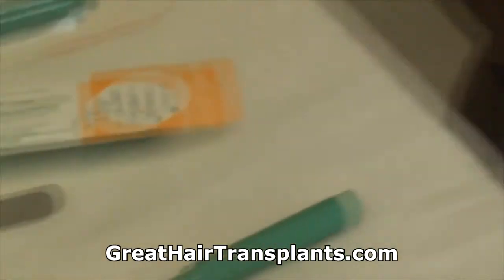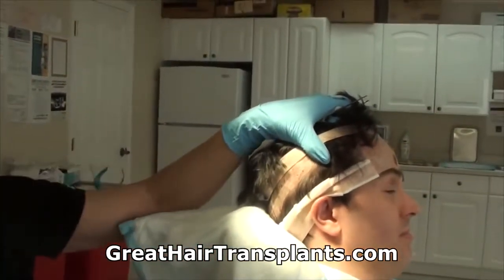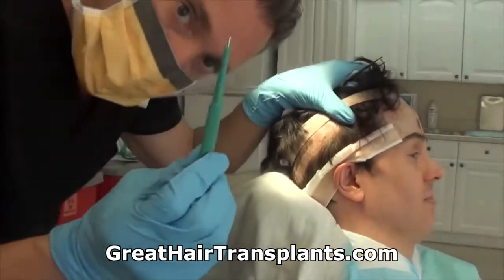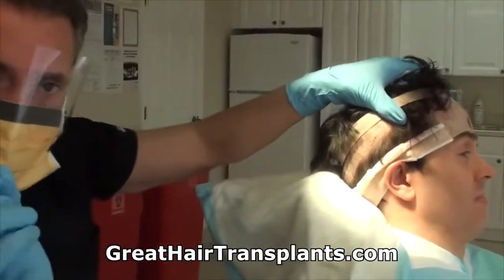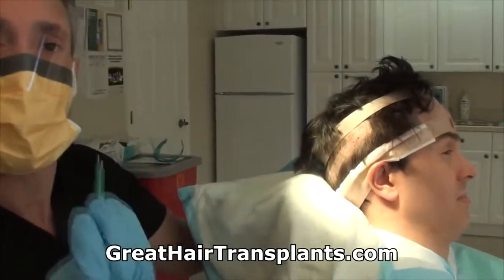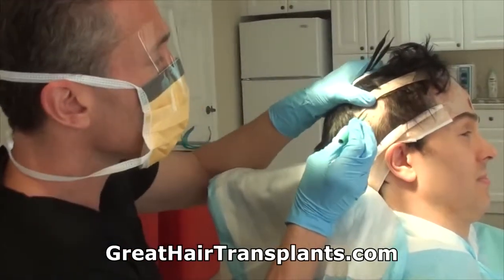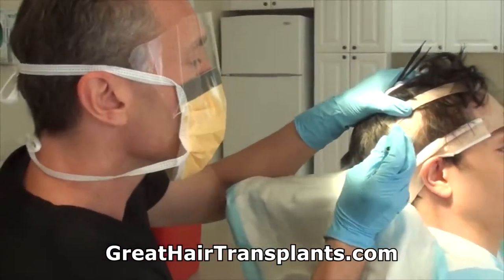Let's go again. Okay. Now look at it. We put these little holes in the patient's head. Okay. This is with a 1.5 millimeter punch. Most doctors use a smaller one than this. So there's much more room for error with the smaller instrument. So now let's try another graft. Okay. Look at this little guy. Here's a nice big one. Let's try to get this guy right here.